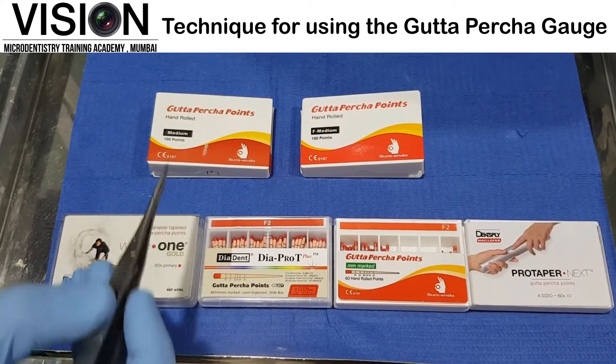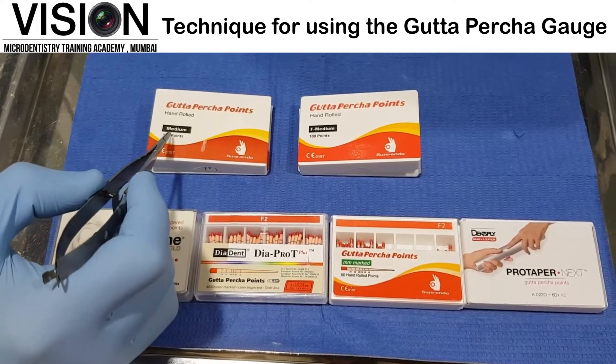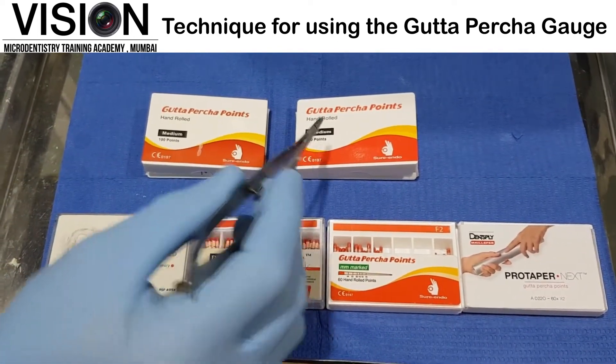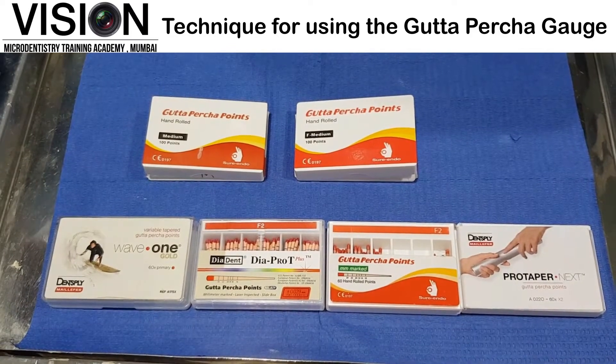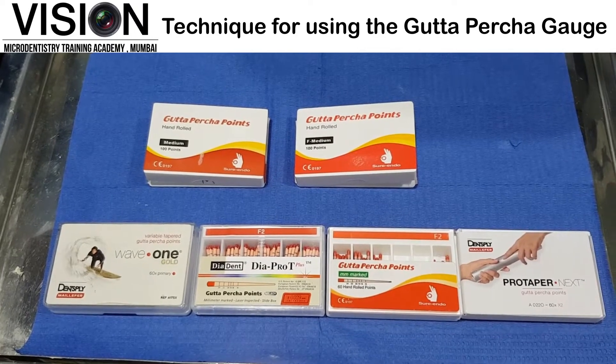Whereas on the top row, we have these two different points which say medium and fine medium. These are basically non-standardized Gutta Percha points, which need to be customized as per your apical gauging.